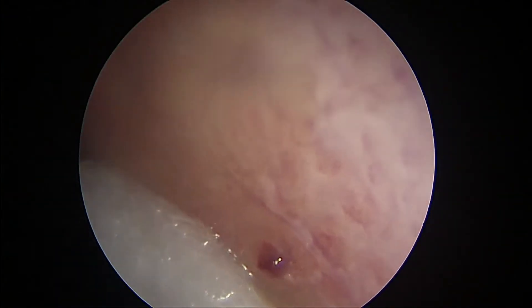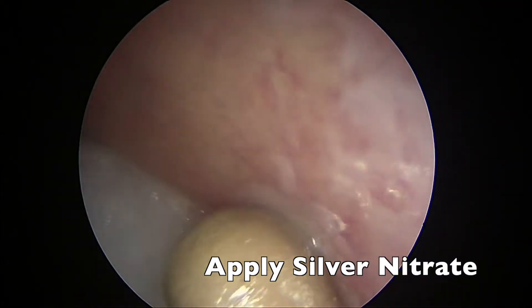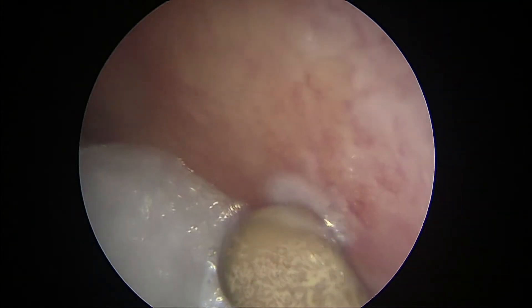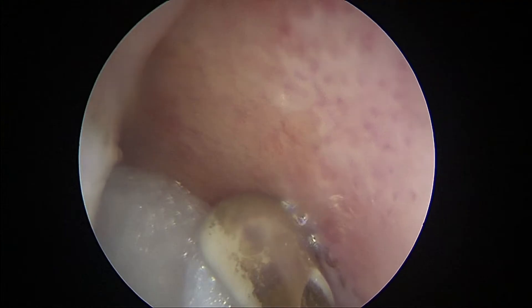After we anesthetize it, I'm going to apply silver nitrate. I leave the cotton ball just behind this area. The silver nitrate can be messy — I'm just going to apply it on the area where it likely has been bleeding, and indeed, once I touch it, it does start bleeding.